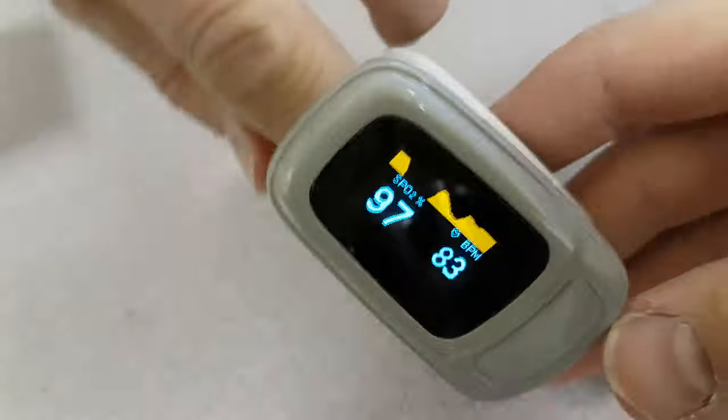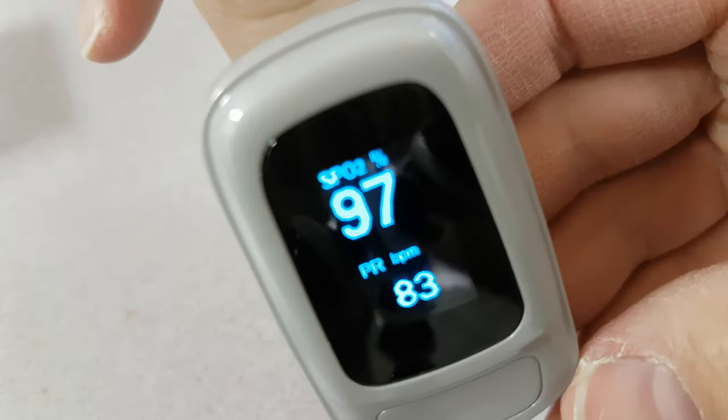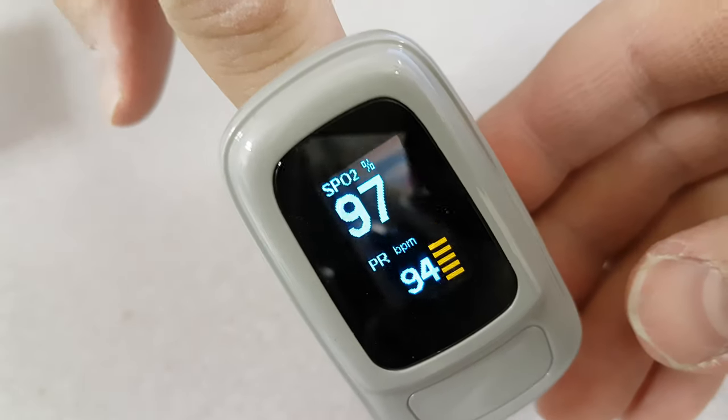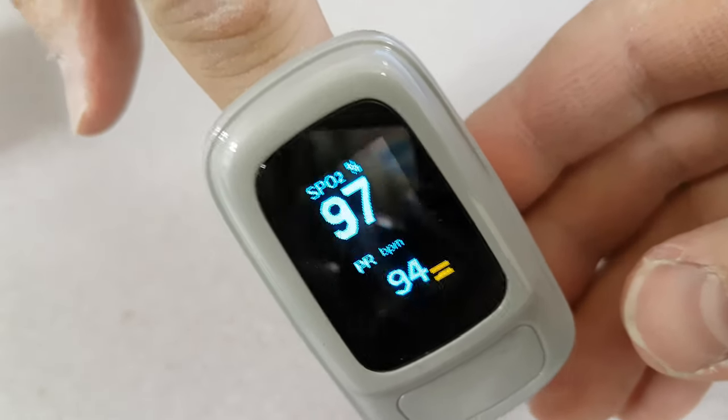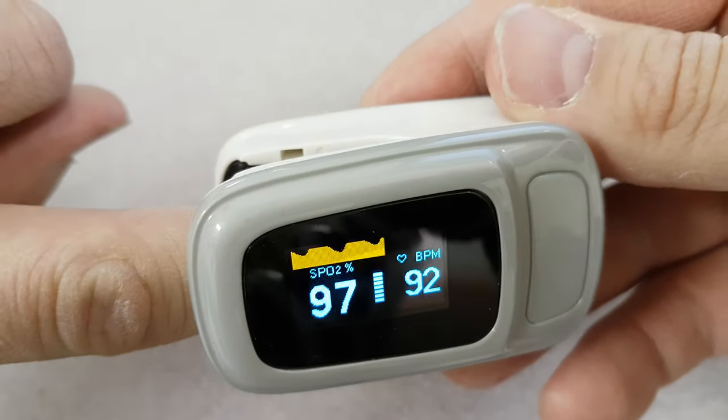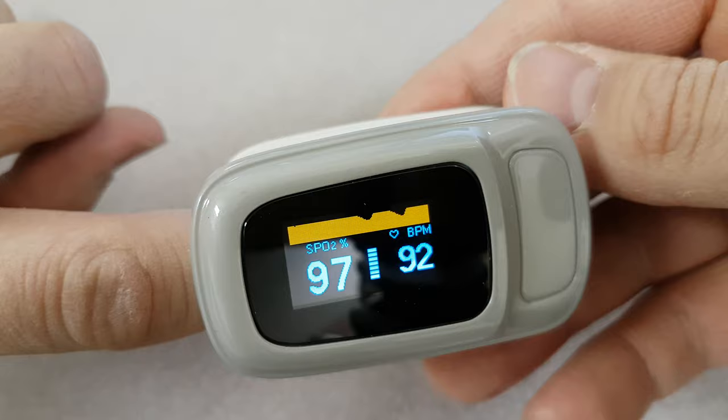It's quite nice — if you turn it around in different orientations, it actually shows the data in a different way. It has an orientation sensor in there as well, so it displays the beats in a slightly different way depending on how you hold it.